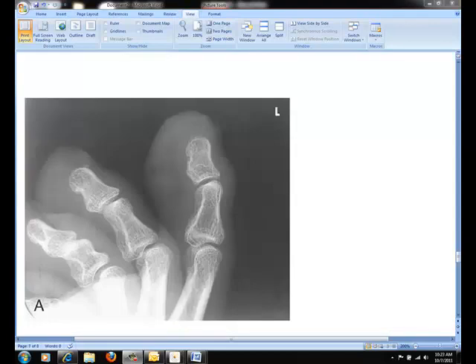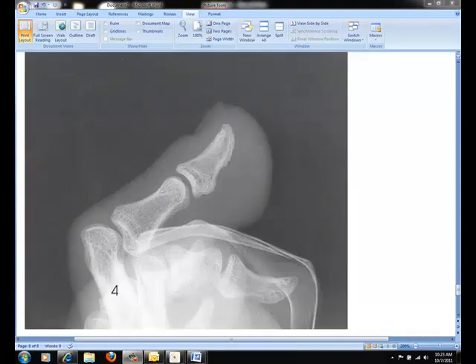Notice in the following images, there is evidence of proper collimation, the toe of interest without superimposition of adjacent toes, and there is soft tissue and bony trabeculate detail. You are now ready to complete a toe series.